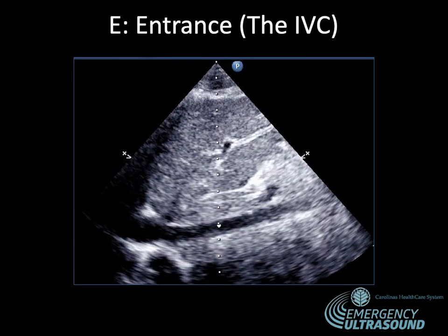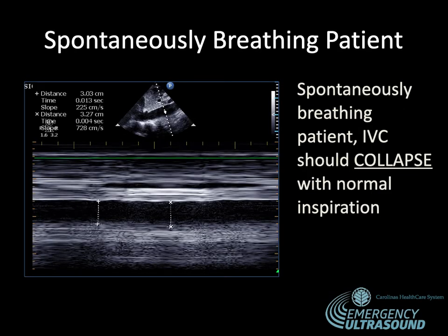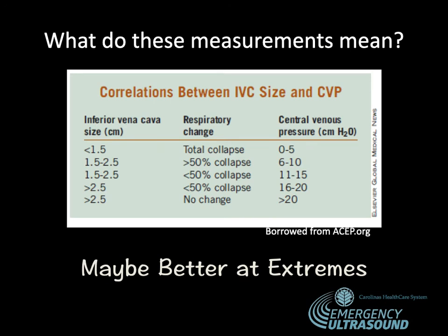Our final E is the entrance — the IVC. We look for the confluence of the IVC as it enters the right atrium, and also identify the confluence of the hepatic veins entering the IVC. We look distal to the hepatic vein confluence for a normal pattern of collapse with respiration. In a spontaneously breathing patient, the IVC should collapse with normal inspiration. Correlating IVC size to central venous pressure works best at extremes — a plethoric, large non-collapsible IVC versus a completely collapsible small IVC.